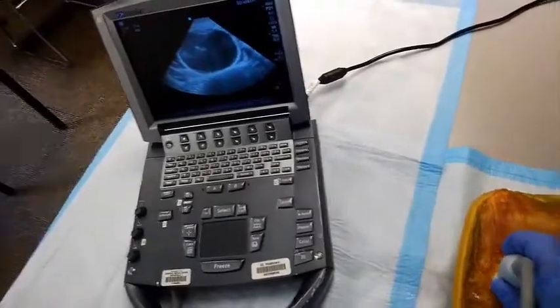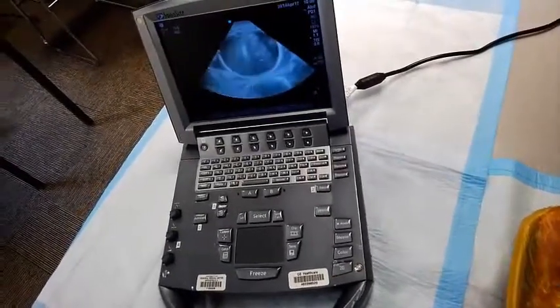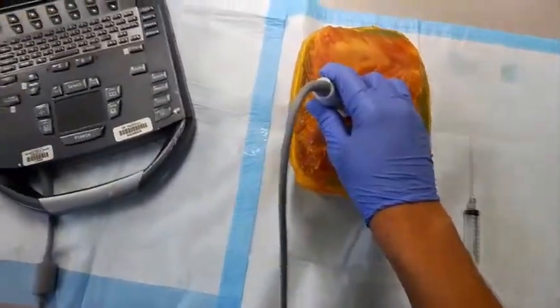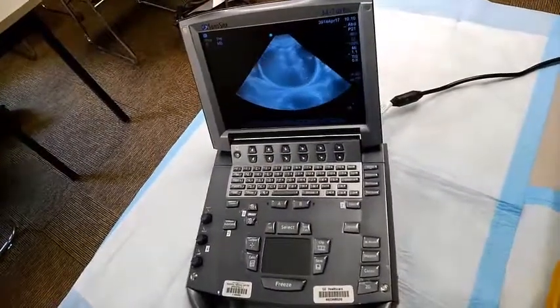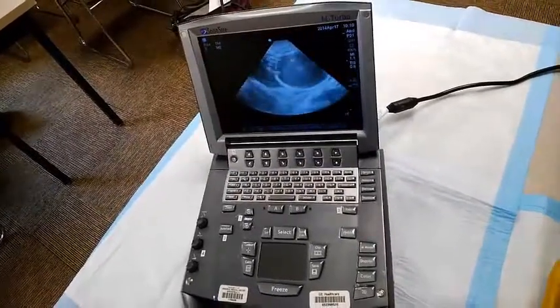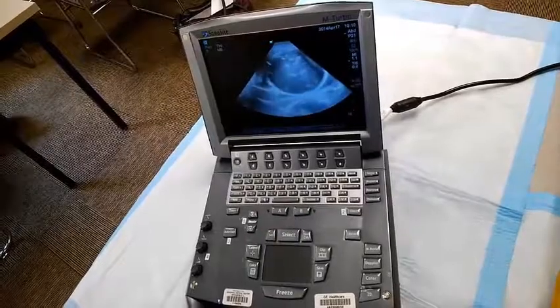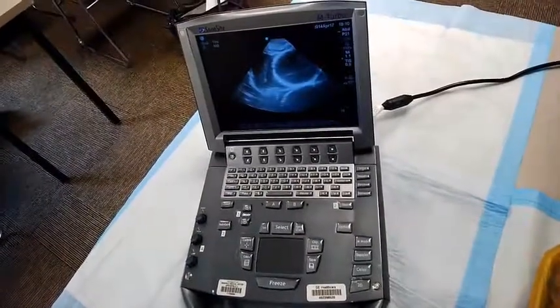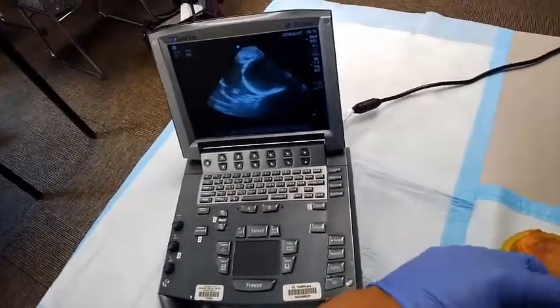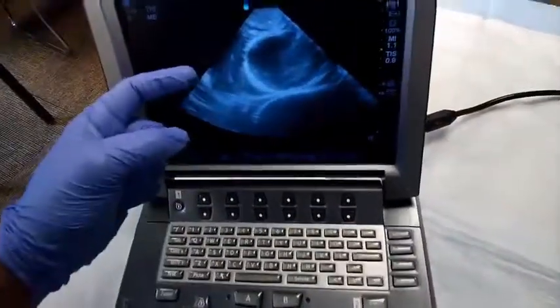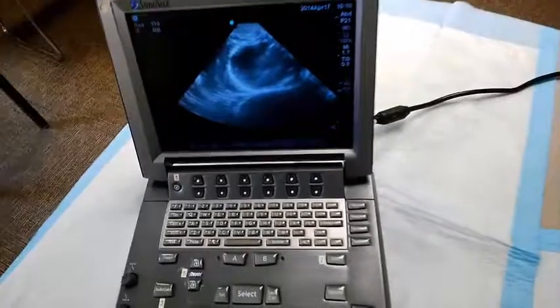Using this model, say we want to get a pericardiocentesis using the parasternal long view — we're looking for our area of greatest fluid dependence. If I have to go down a rib space, you're right around here. Just like you would in a parasternal long, I'm looking at the screen; here is where my probe is, and this would be the area of interest where I want to get some fluid taken off.